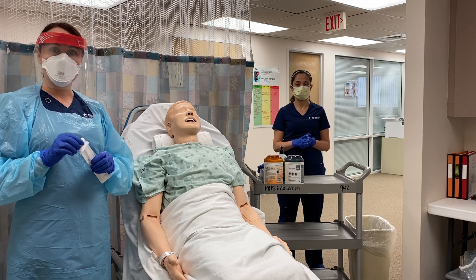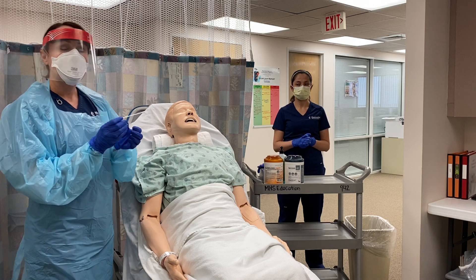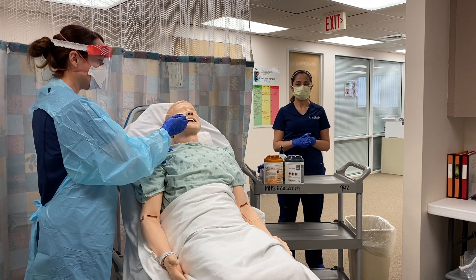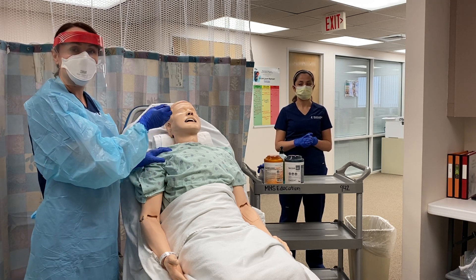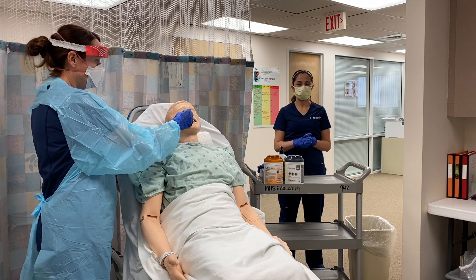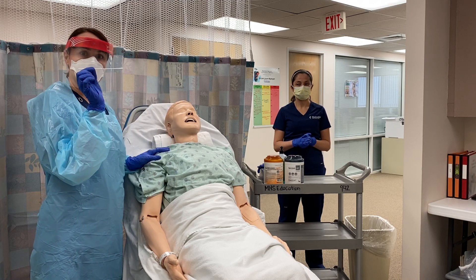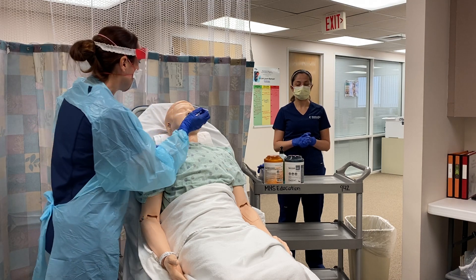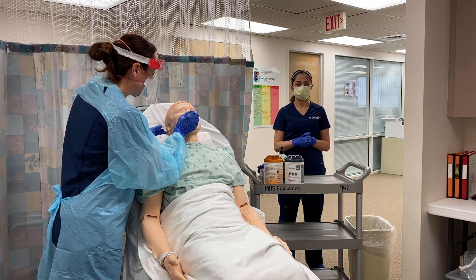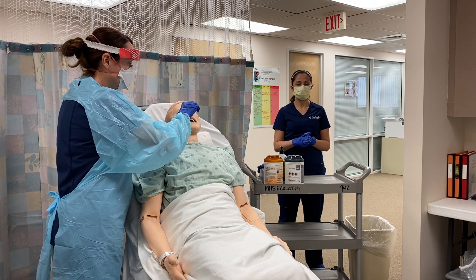Now I'm going to go ahead and perform the nasopharyngeal swab. I'm going to take my swab. Whenever you do the swab you want to be sure to insert it holding it parallel to the patient's palate. You're going to insert until you feel resistance, which should be about the distance from the patient's nostril to the front of their ear — on our patient here, that's about right to where my fingers are. Go ahead and insert the swab, again holding it parallel to the patient's palate, until you meet resistance or reach the required distance, and then begin to gently twirl the swab.